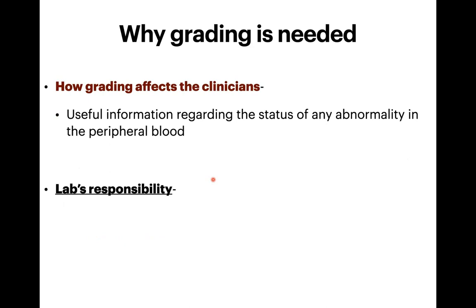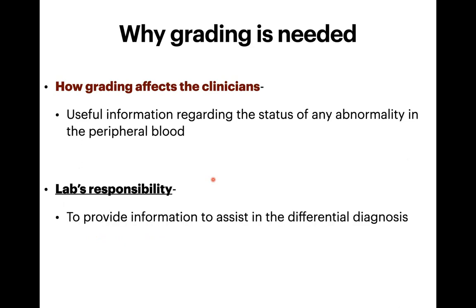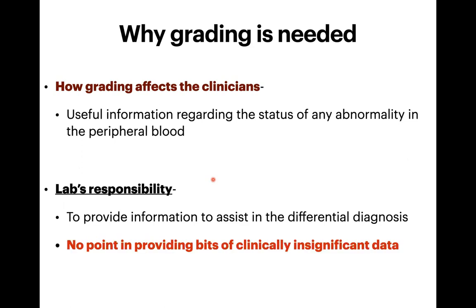And what is the lab's responsibility? The lab's responsibility is to provide information to assist in the differential diagnosis. When we don't grade, we are not giving them useful information, and there is no point in providing bits of clinically insignificant data. That's why it is very important that you don't just describe which cells are present, you also tell how many of these cells are present.